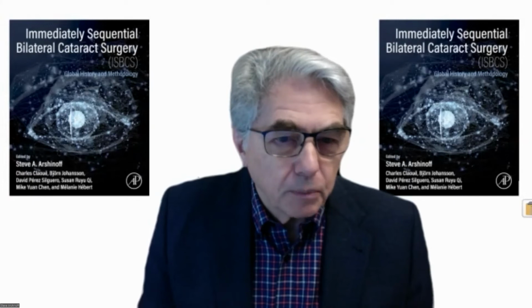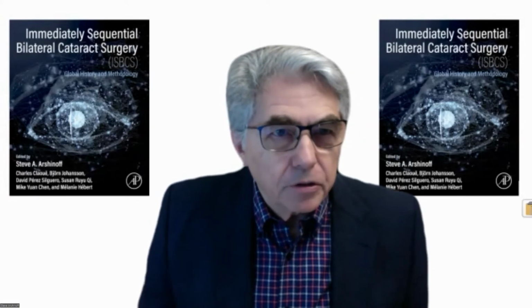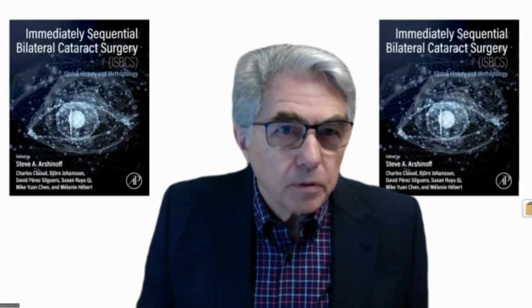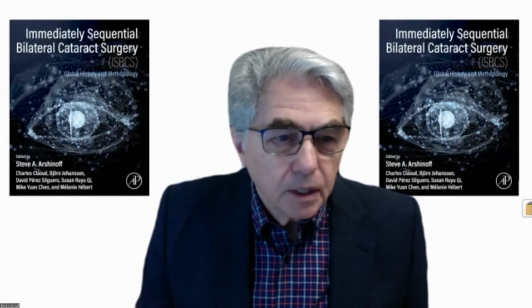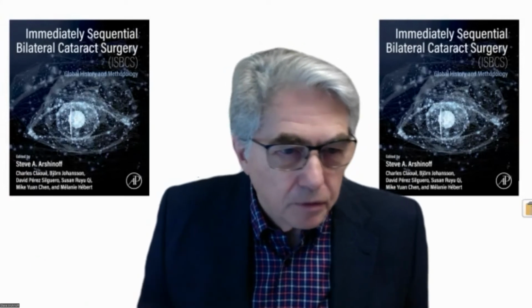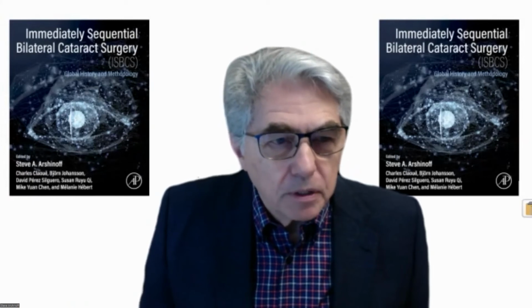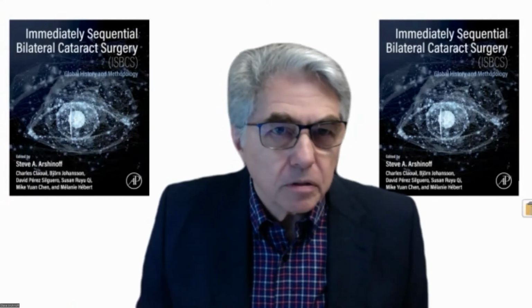HPMC was first made by Fechner in '76 in his basement in Germany. And the Germans and then some other countries, well, India, began to first make HPMC. The first company to manufacture it commercially was Shaw and Shaw in Calcutta. And they made it, I think, in '78 or '79. And they began to say that it was the same as Healon. And because it was inexpensive, it was used a lot in India and various places.